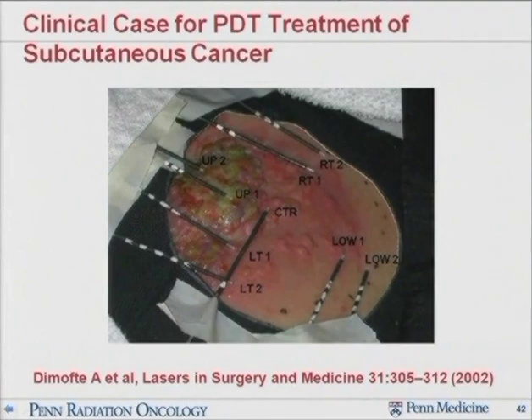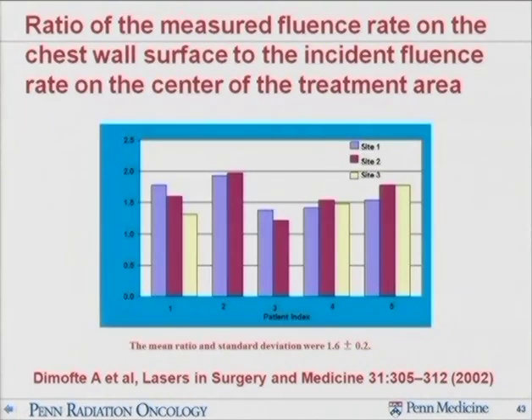And you can see that we put the detector in different locations. And so the optic property below is a little different depending on locations. And these are the summary of the result, which is showing that, as I mentioned before, the light fluence rate is always higher than the irradiance, so by a factor of about 1.6. Okay, and also it is patient to patient dependent.